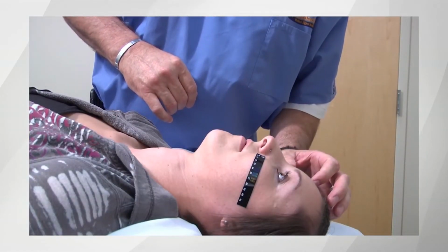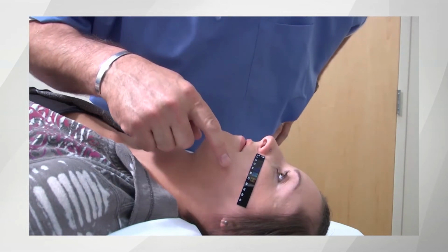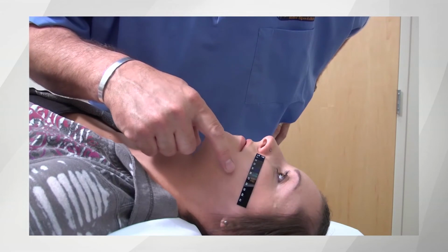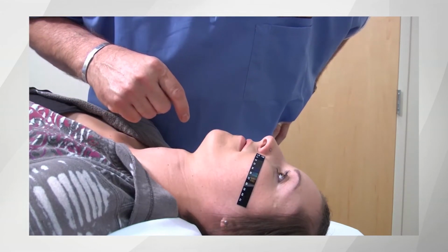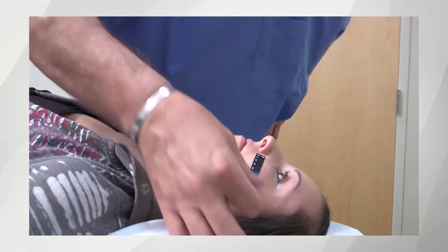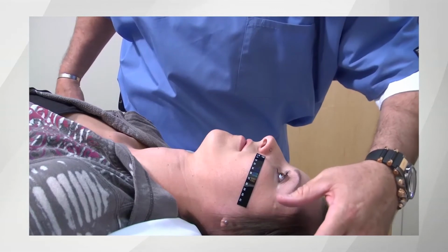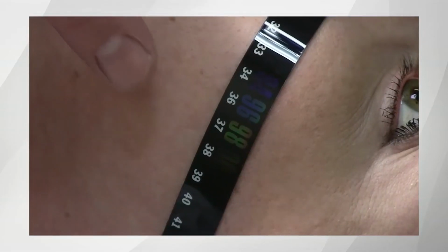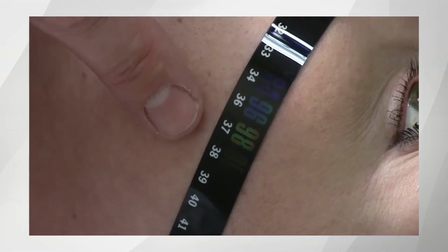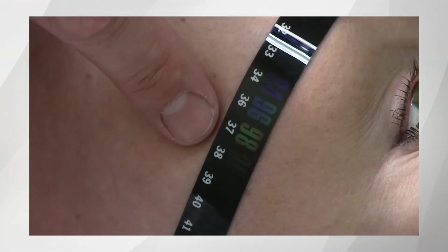The practitioner begins to assess the physiologic markers of successful procedural application. These include: 1. Tearing from the lateral canthus, 2. Conjunctival redness, and 3. Most importantly, a 3 to 5 degree temperature increase as shown on the microcrystalline temperature strips. Documenting the temperature increase is essential to demonstration of a properly performed procedure. It will also provide proper billing-related validations.